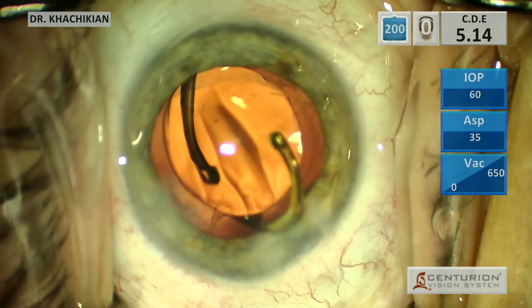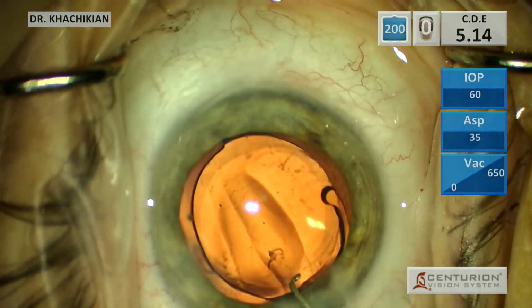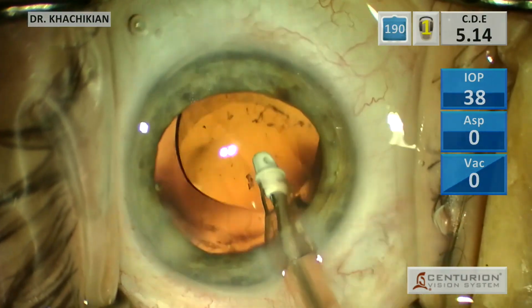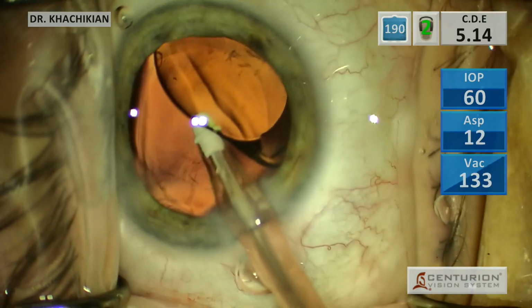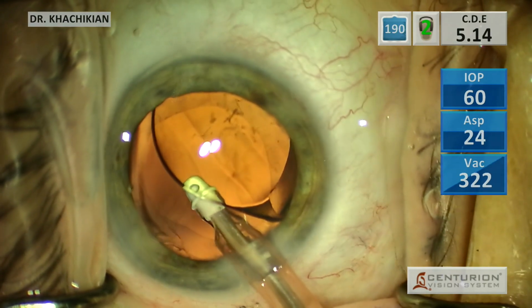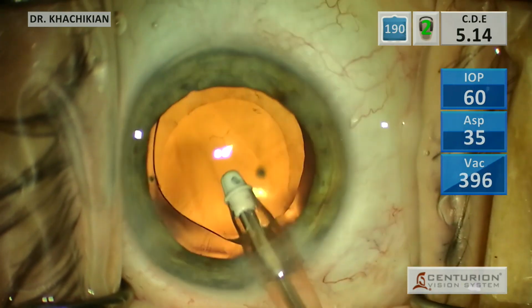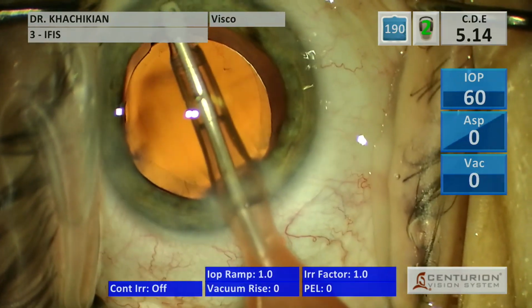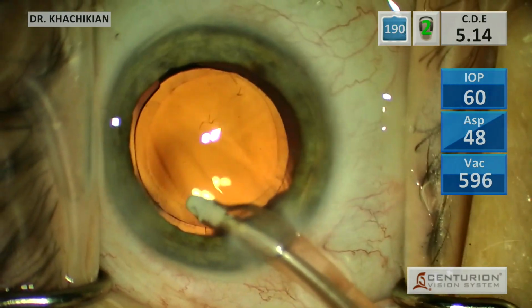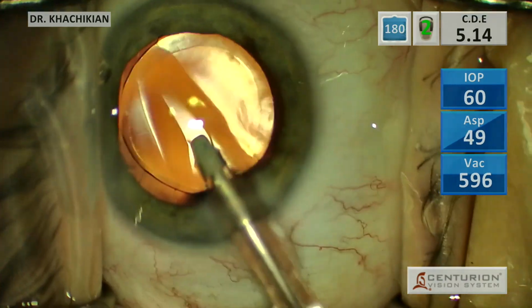So we will gently get our one-piece lens in the bag. I don't think that this patient needs a three-piece lens in the sulcus, but you could do that as well in addition to your capsular tension ring. Then we'll go behind the lens and get out all of our Provisc. You can still see there's some strands of cortex remaining there, and it's probably not worth trying to get those out because right now they're stuck behind the capsular tension ring. So we'll sweep the angle, make sure there's no remaining viscoelastic there.